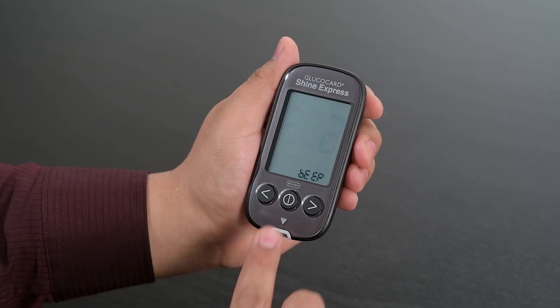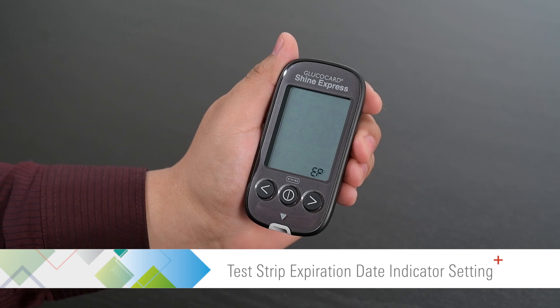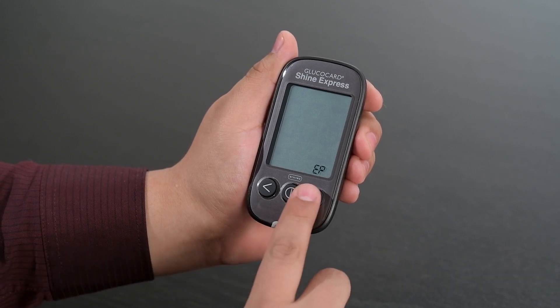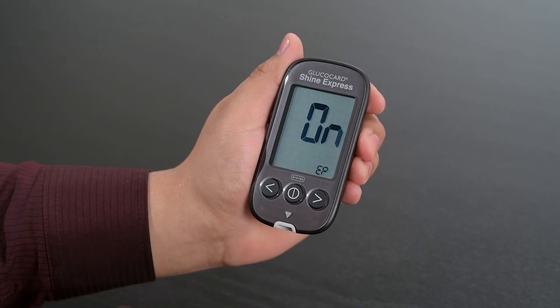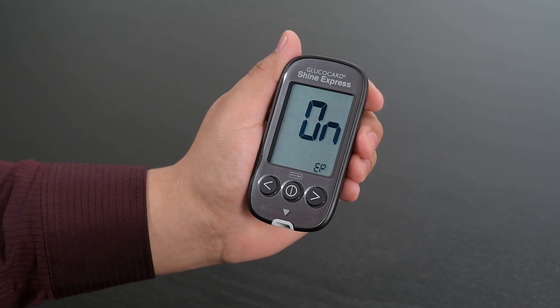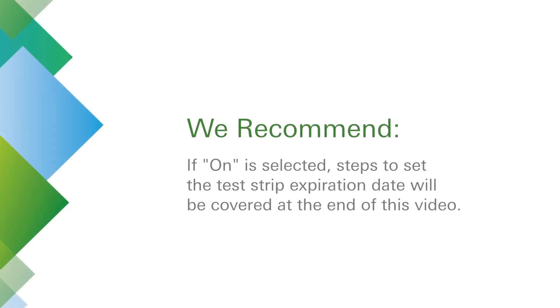Then press the center button to proceed to the test strip expiration date indicator setting. Use the left or right arrow buttons to turn the test strip expiration date indicator on or off. If 'On' is selected, steps to set the test strip expiration date will be covered at the end of this video.